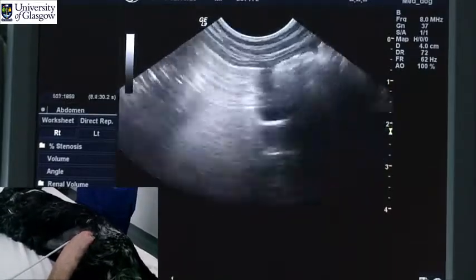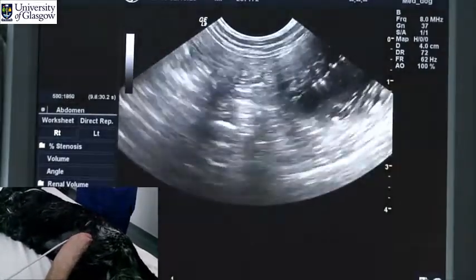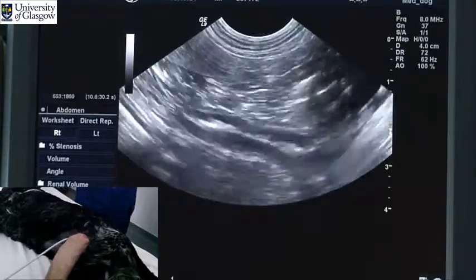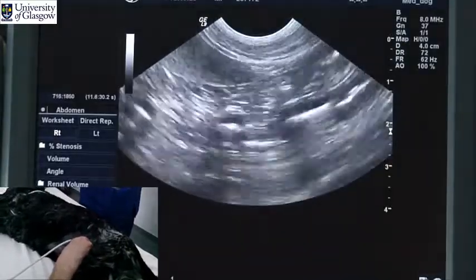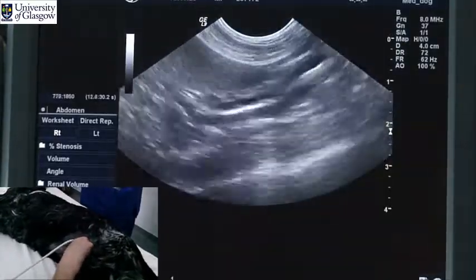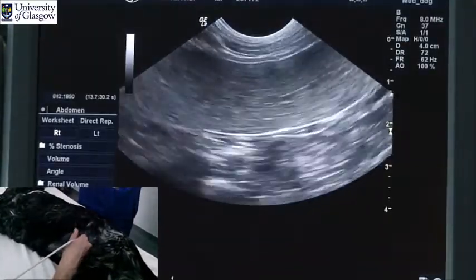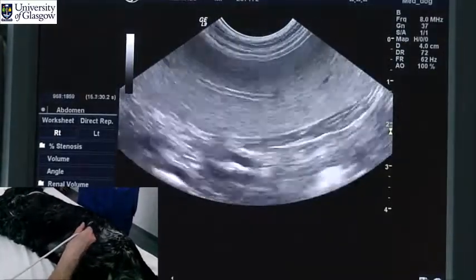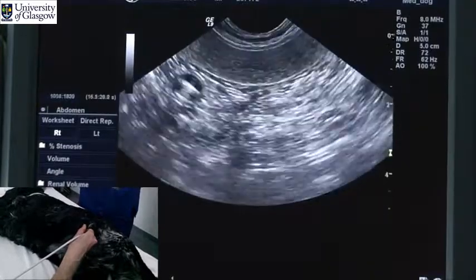We are generally looking for evidence of obstruction, intestinal masses, free fluid, and that sort of thing when scanning through the mid-abdominal area.